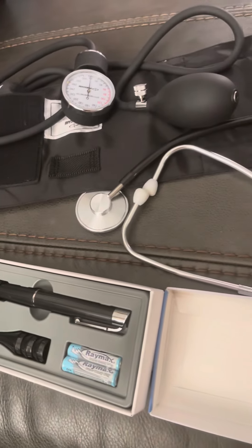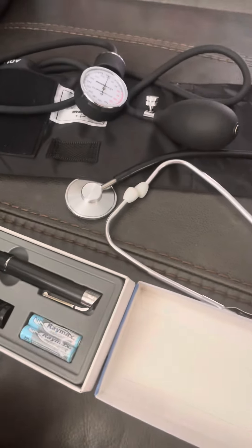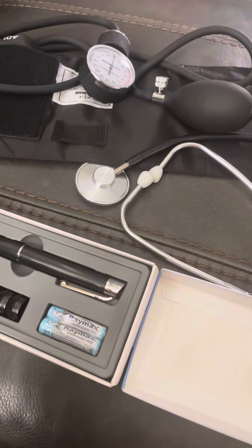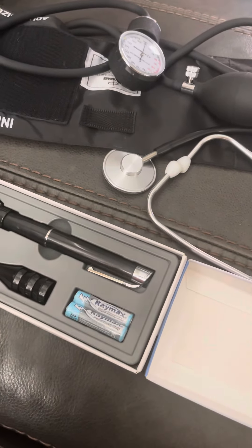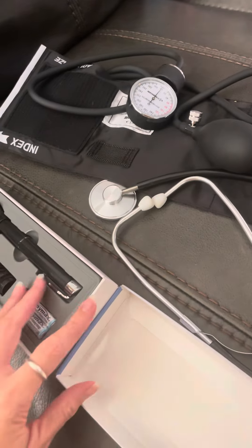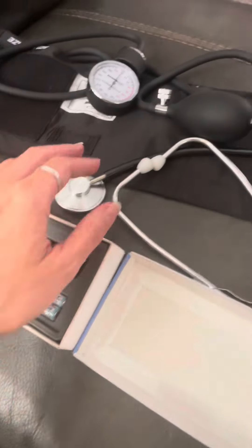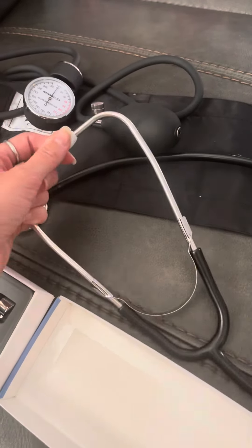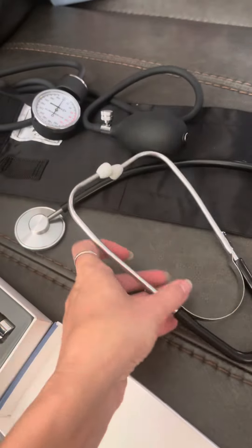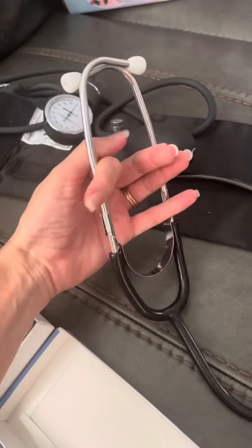Hey everyone! So I got this doctor's kit off of Amazon because my kid is obsessed with being a doctor, but I didn't want to get him that cheap childish stuff that breaks. I wanted to get him something that looked like the real thing. And the thing is, this actually is the real thing. Now it is a very cheap set — I'm not gonna say it's the best made thing ever, because it's not.